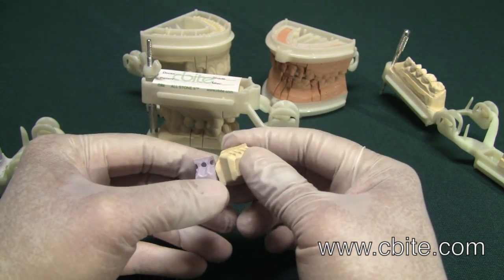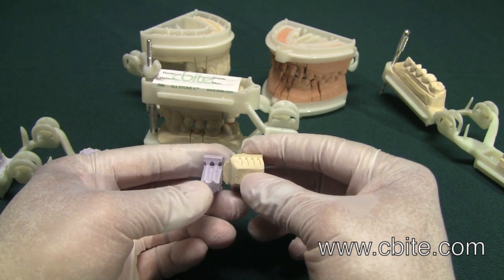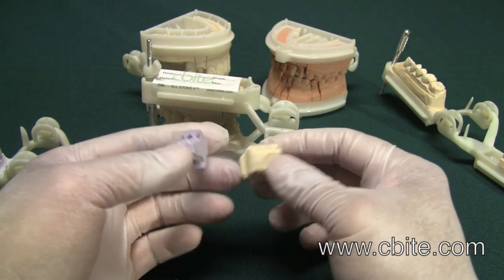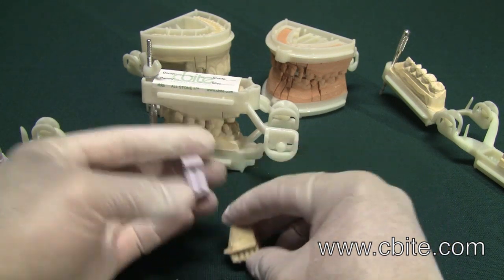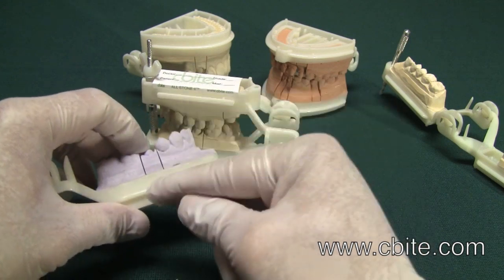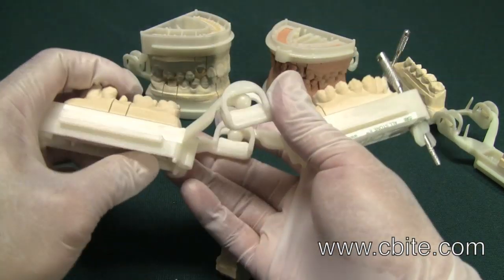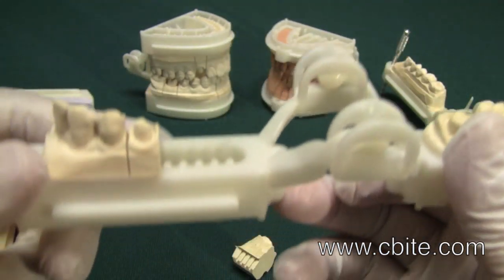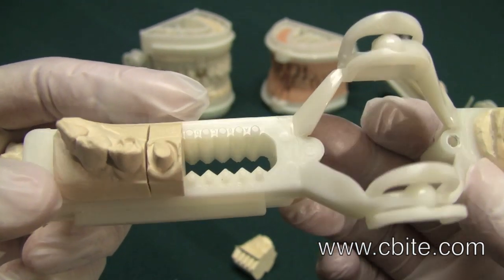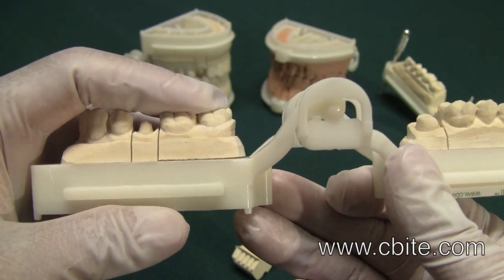We have kept the surface stabilizer that exists on the original Allstone 1, which the Allstone 2 does not have. We kept it because the stability of the dies really comes from the surface stabilizer. However, we did not make them as tall, so they are shorter, which makes it a little easier to take the dies in and out.